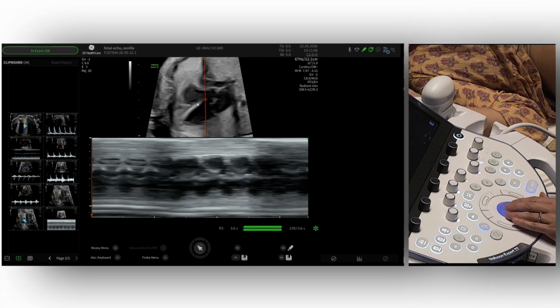Then it will show some other things, the septum and so on, but at the end we'll be slicing the ventricle. Here we see how the ventricle is contracting. So in a different way, we are showing at the same time one atrial contraction, one ventricular contraction, the atria, the ventricle, the atria, the ventricle. Again, in the same image we get the atrial and ventricular contraction, so we can measure the ventricular heart rate, the atrial rate, and also the AV and VA relation.